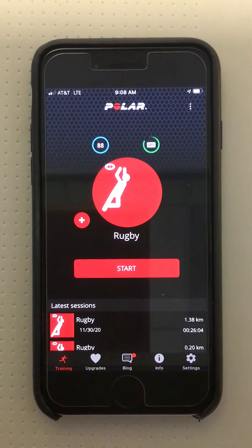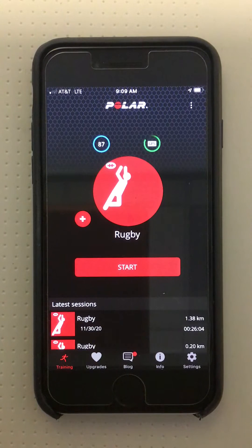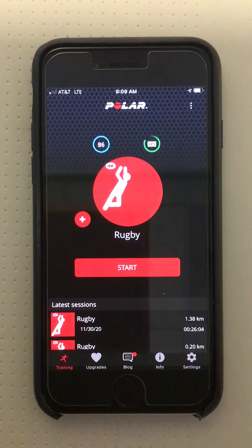The purpose of this third training video is to instruct on the features of the heart rate readout, and specifically what the changing text color means.